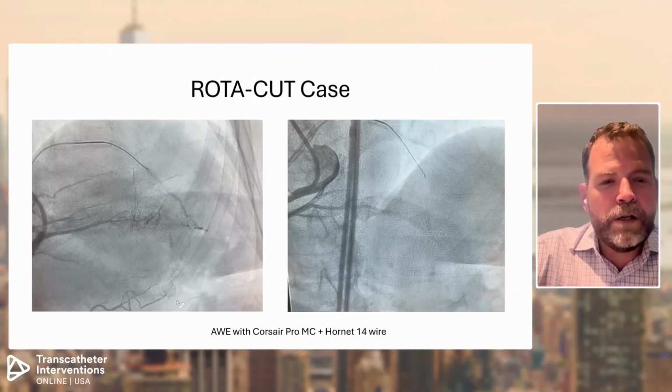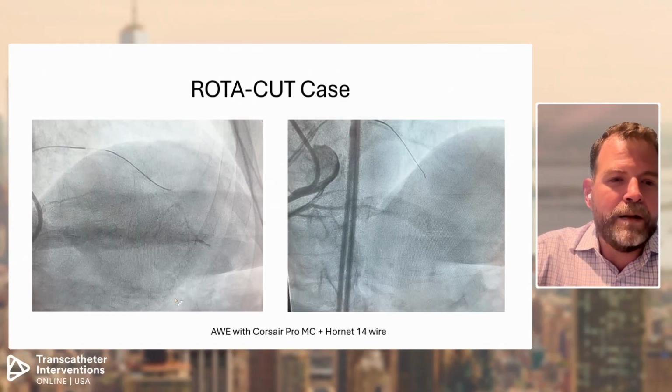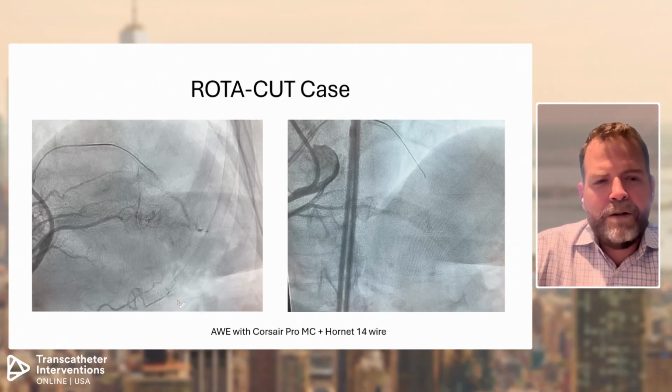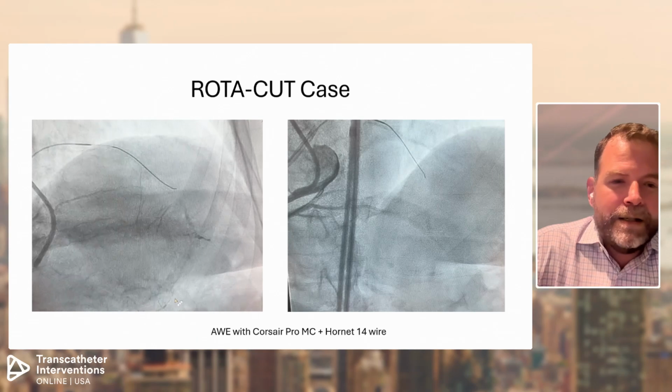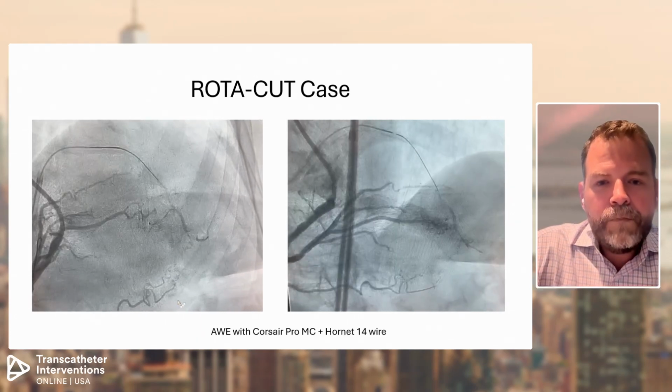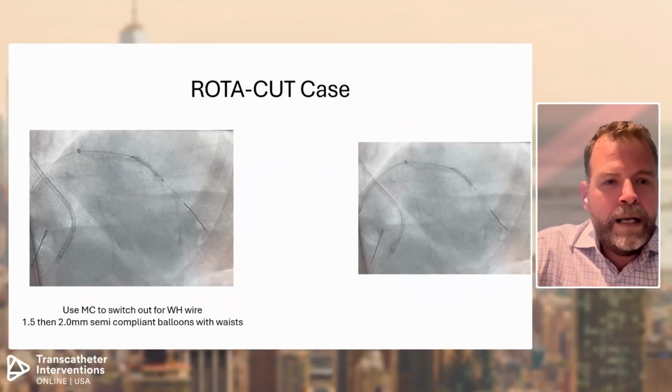And the Hornet 14, unfortunately, goes true to true, which again, some people would say, well, that's really good. Not really, because I don't really want to deal with the calcium. I'd actually just rather go around it. But in this case, it does what it is. So you can see in multiple views, the Hornet 14 is down, and so fine, I guess we'll move on.